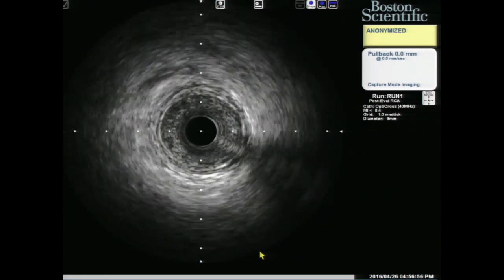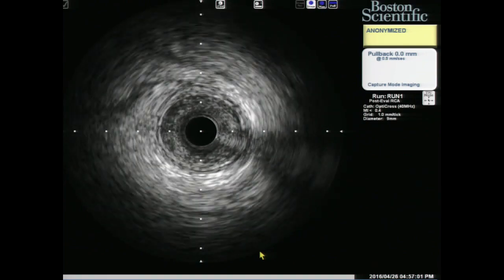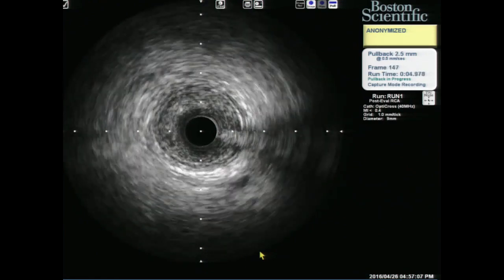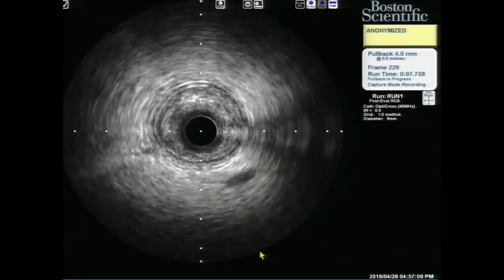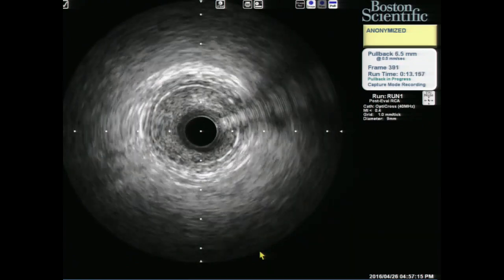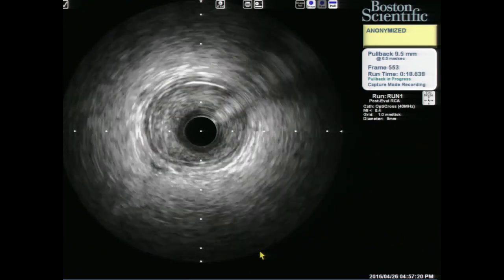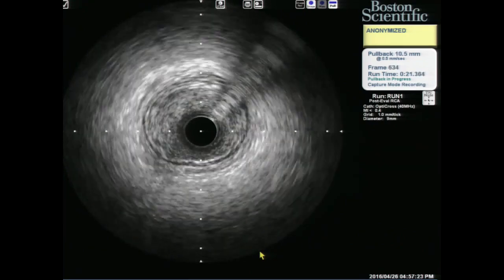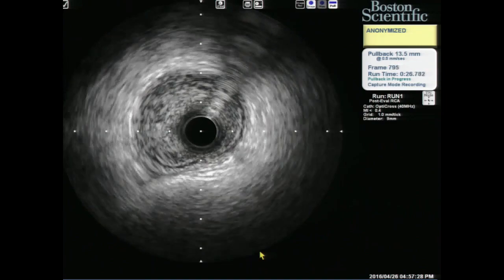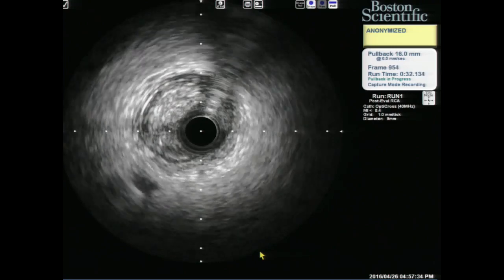So this is the inside of the tricky channel here. Could you pull back? Because the Crusade cannot pass and IVUS cannot pass, usually it's better to do the 2.0 balloon. Could you record and pull back? Okay, pull back. So maybe inside this channel the vessel size is almost 3.0. Here is the most proximal side inside the channel.